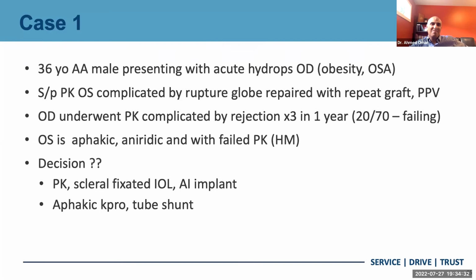Okay. Very good. Oh, we got another choice for that. Maybe. Did you have one way you were leaning, Dr. Omar? Do you want to talk about what your choice would be and why? So initially, when I first saw the patient, after I did his PK in the right eye, that was my choice to do the PK and the sclerofixated IOL and the artificial iris for the left eye.